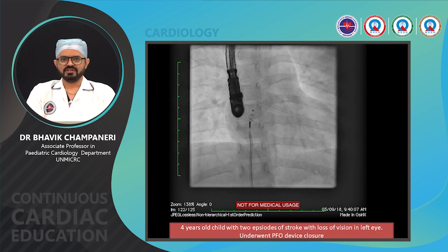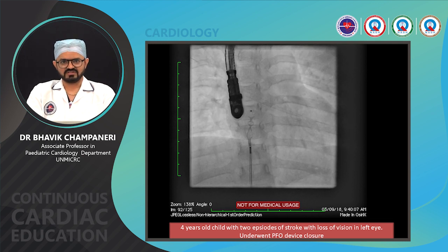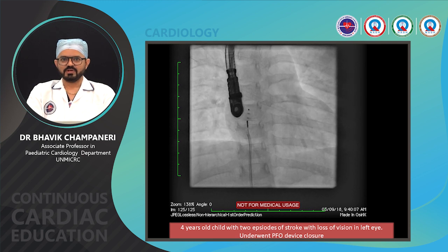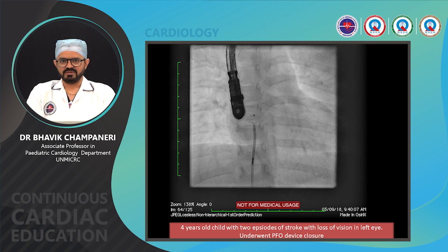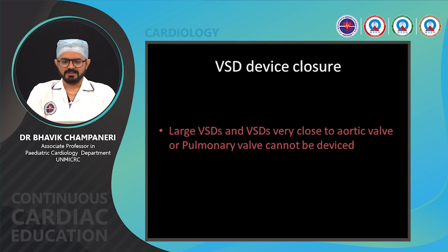It's a device which is being used for closure of PDAs or VSDs, but in this rare case, because the child was overall small and the ADO2 seemed adequate to close this PFO, this child underwent PFO device closure with an ADO2 device.